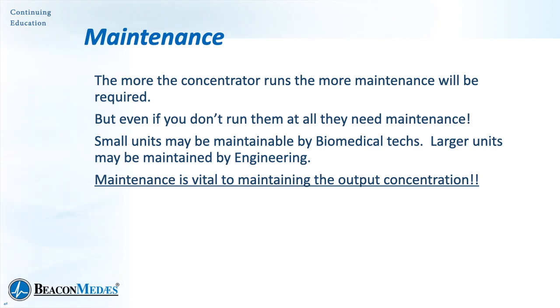All concentrators need maintenance. The more you run it, the more maintenance you're going to need. That's pretty logical. But keep in mind that even if you don't run them, they may still need maintenance. Small units, portable units, are often maintainable by the biomedical technologists. Larger units will need to be maintained by engineering. The appropriate training is very important, because maintenance is essential. If you don't do your maintenance, you will not be happy with the output from your oxygen concentrator.